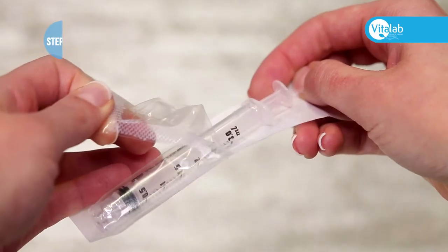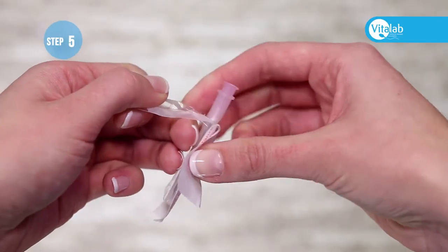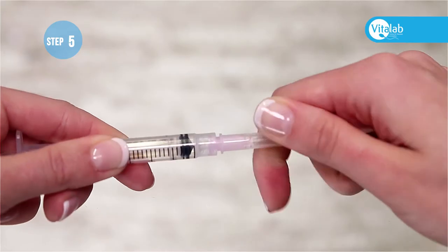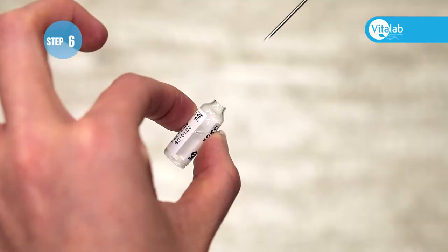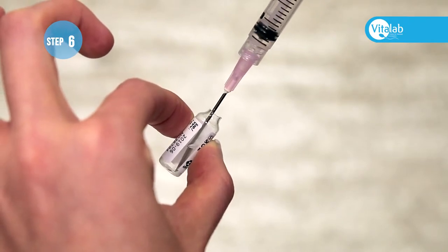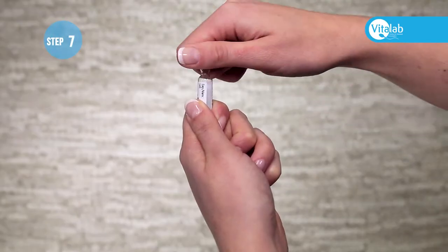Remove the syringe from the packaging. Remove the large pink mixing needle from the packaging and attach the pink needle onto the syringe, making sure that the needle fits securely. Put the needle in the bottom corner of the water ampoule with the bevel side to the bottom, and suck all the water into the syringe.